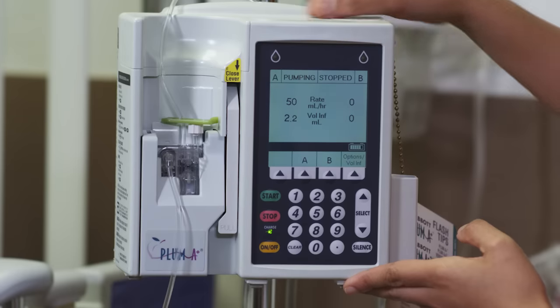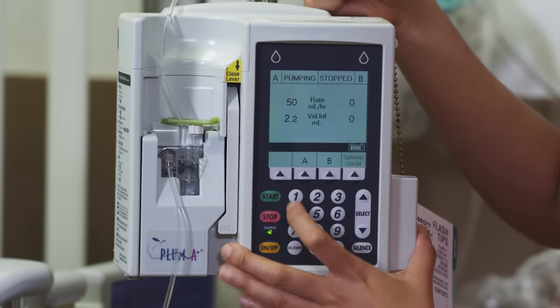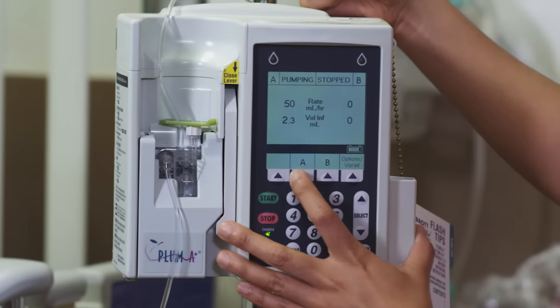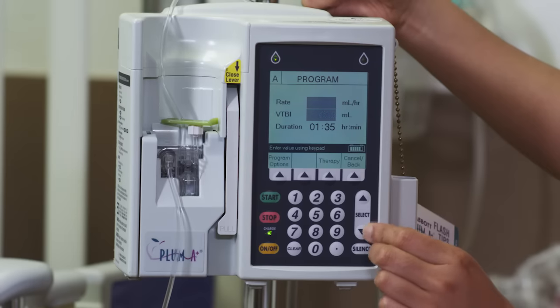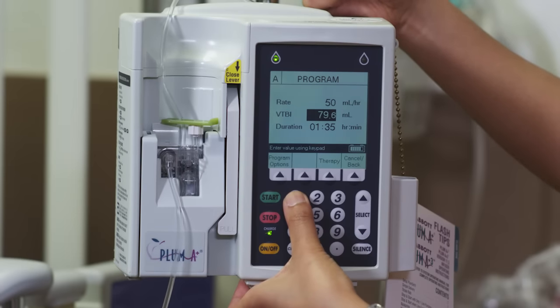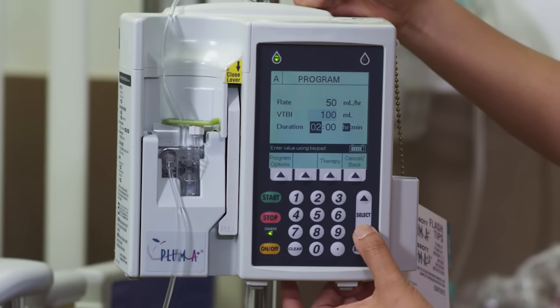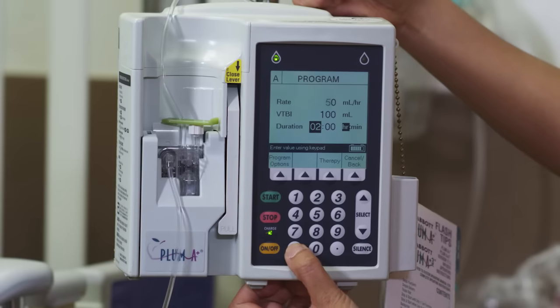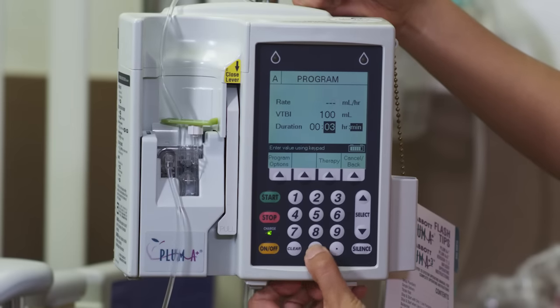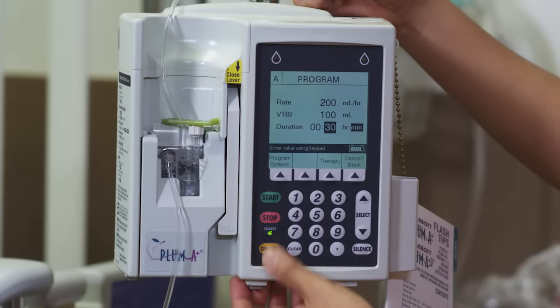If we want to give our patient a bolus — say you got an order from your doctor — pick channel A again. For a bolus of 100 mils, go down to volume with your arrows and put 100 mils, and you want to give that over 30 minutes. Clear the hours field, then go down to minutes, enter 30 minutes, and see how it calculates the rate for you. Then just start.